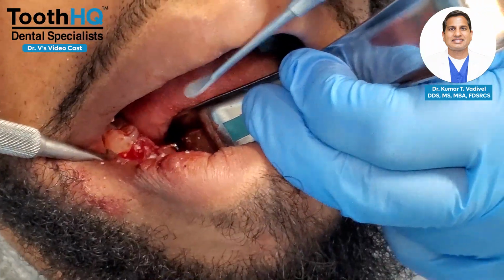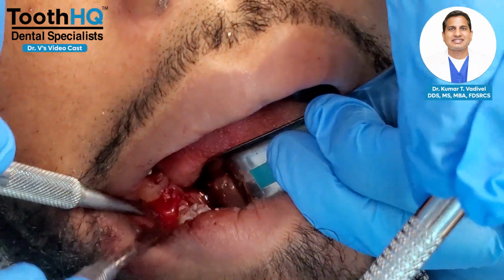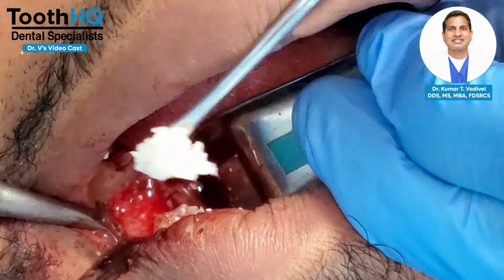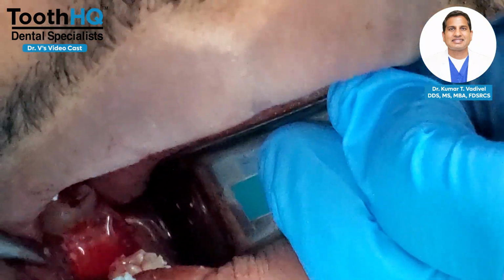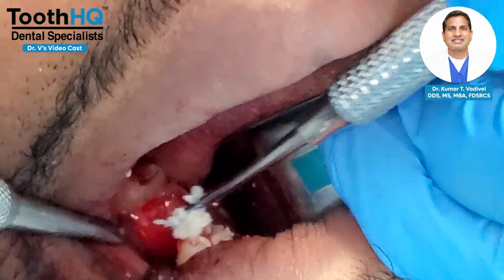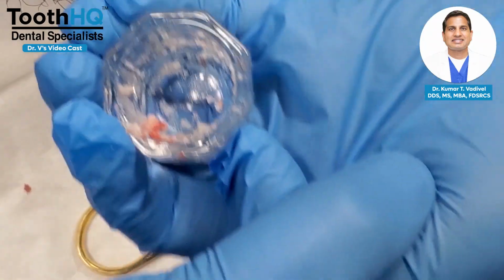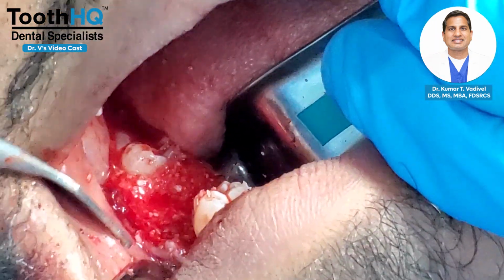Feed me here on the bone, right here. Feed me here, okay? Go ahead and get the bone and feed here. So come, bring closer, okay? Bring closer, okay? See here, that's what I call feeding the bone. Your assistants can feed the bone. Malia is a great assistant. She's feeding the bone here for me. Malia did a great job on feeding the bone. She pretty much fed all the bone to me here. So you can see the whole thing is filled with bone here.